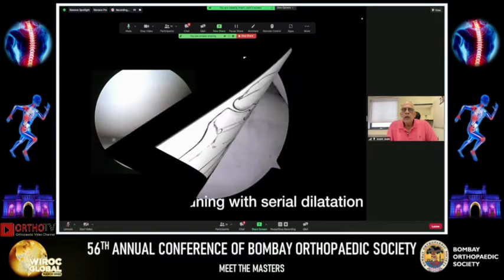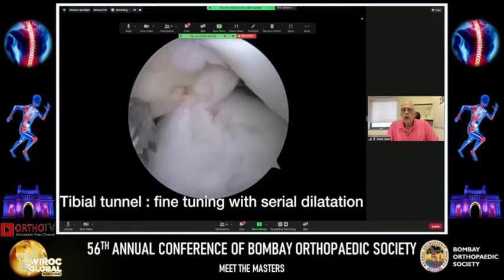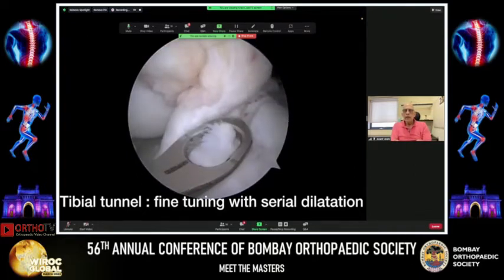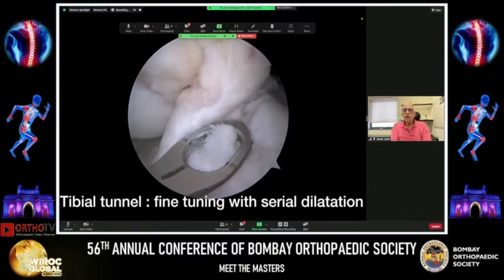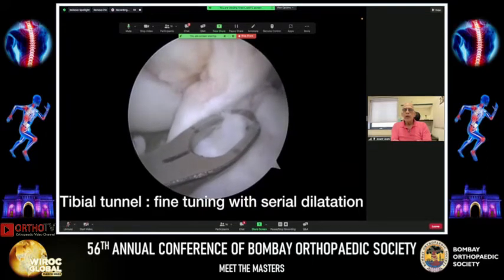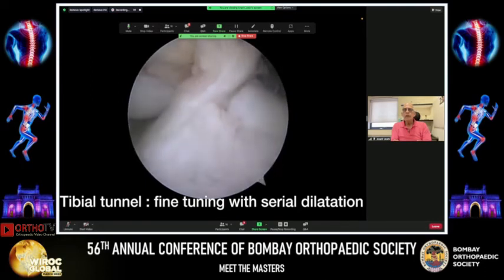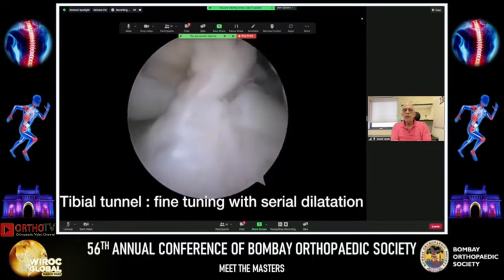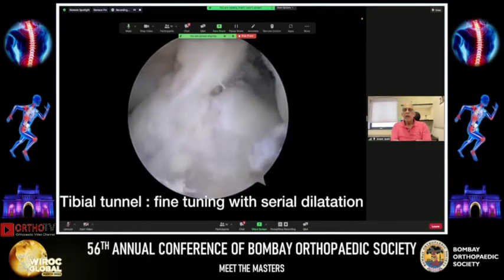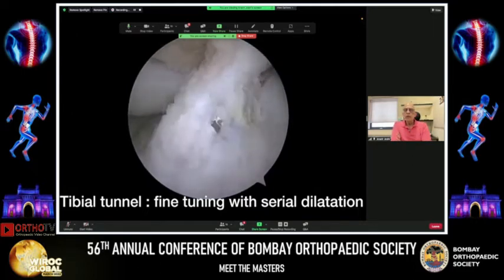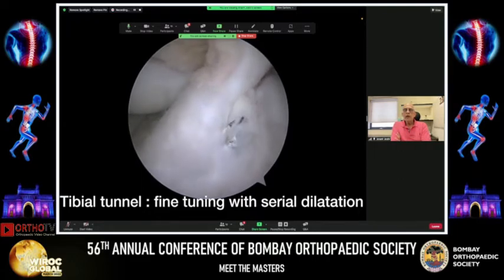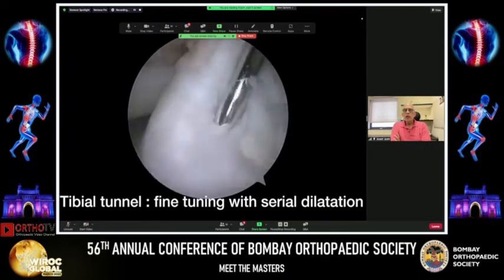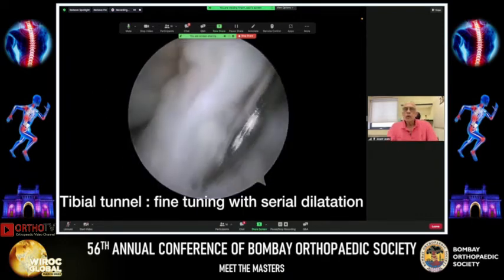For the tibial tunnel, use the tibial spine and posterior margin of the anterior horn of the lateral meniscus as landmarks. I recommend serial dilatation in all cases — starting with a K-wire, then a 7 mm cannulated drill, gradually dilating before achieving clearance. Tibial side bone in young athletes can be quite hard, and drilling directly with wide-diameter drills can cause shattering of the tibial plateau. Serial dilatation is therefore strongly recommended.